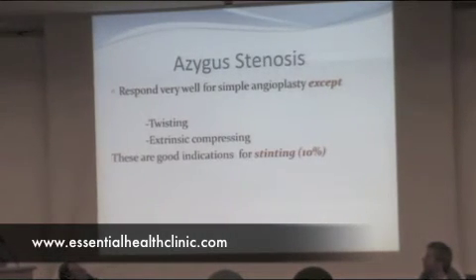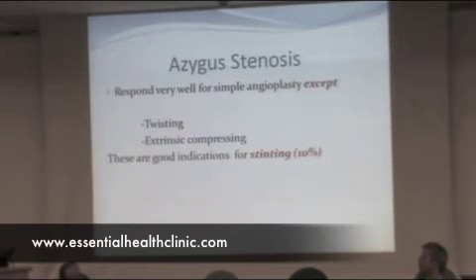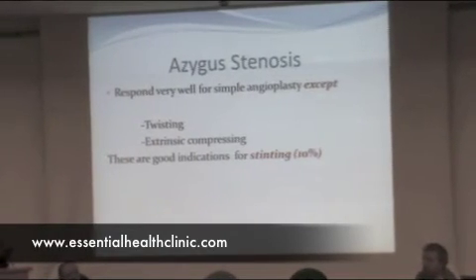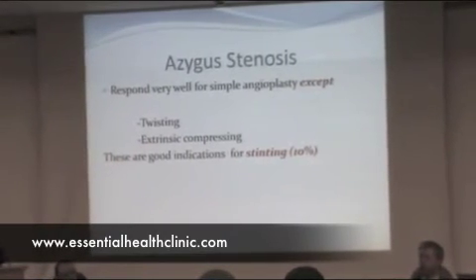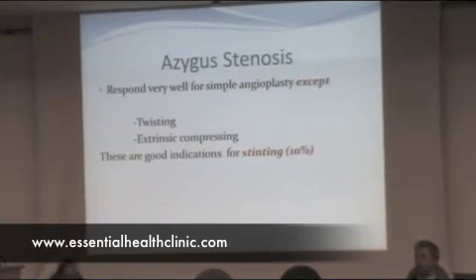Azygous stenosis, in conclusion, responds very well to simple angioplasty, except twisting and extrinsic compression. These are very good indications for stenting, which is found in about 10% of our patients.